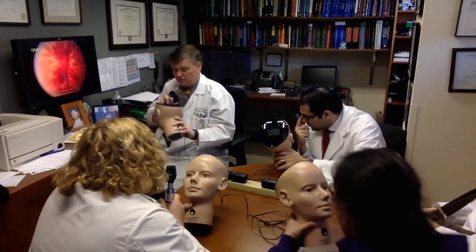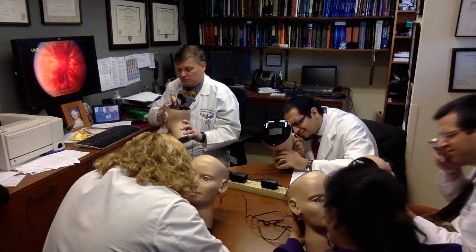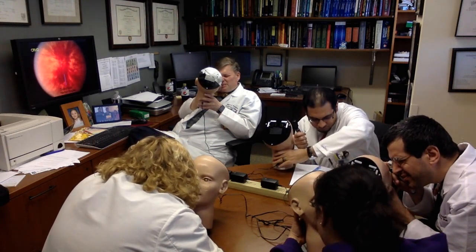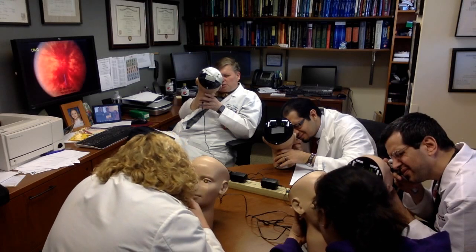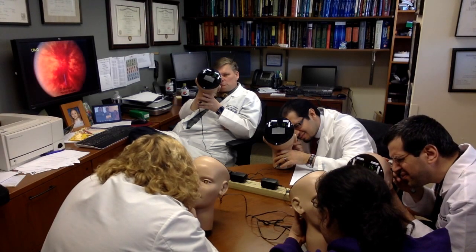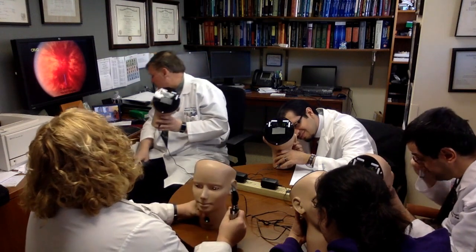That was number 15. Convince yourself that the disc is really, really blurred. You don't see any cup at all. The veins are really tortuous. But the big difference here is there are all these cotton wool spots and retinal hemorrhages, and the hemorrhages are flame-shaped, or they're the dot and blot hemorrhages. Everybody agree? Good.